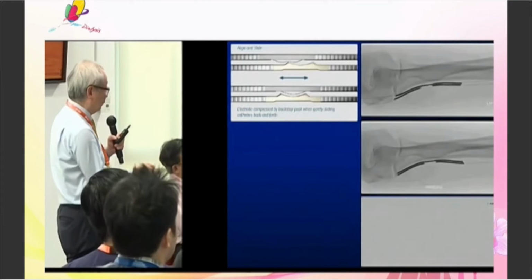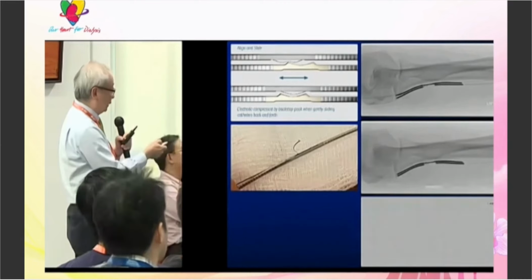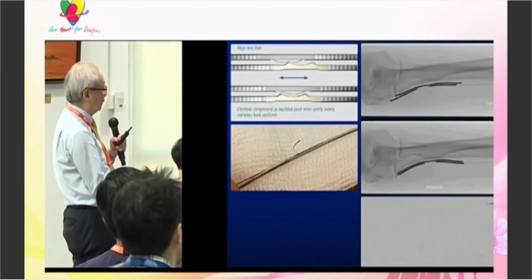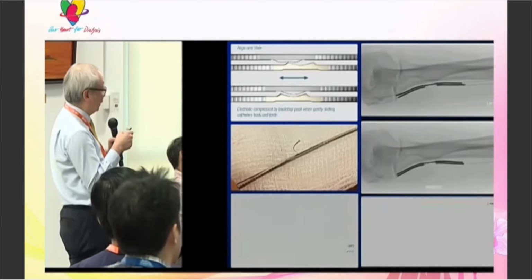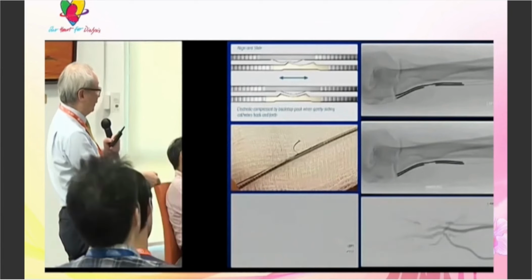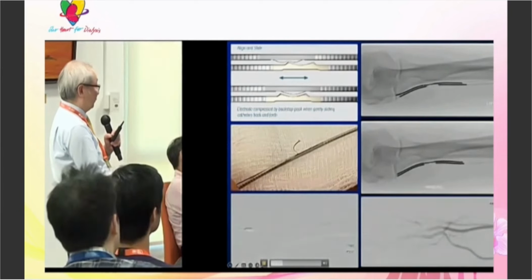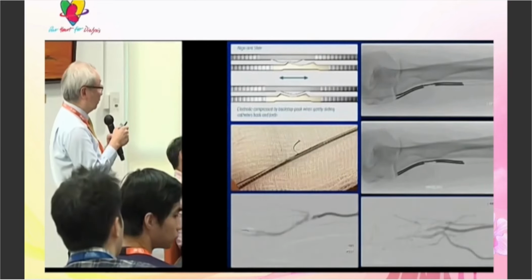And then when we take out the venous catheter, we realize that actually it's faulty. It is mangled up. So we had to put in a new one. And this time around, it works. Can we click on this last video? So injection from the radial artery, now we see the superficial vein.